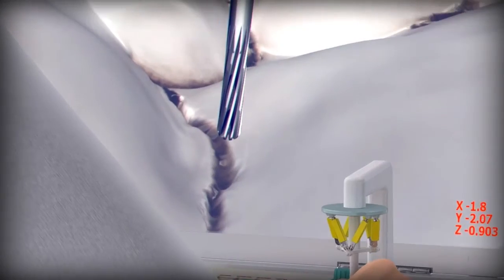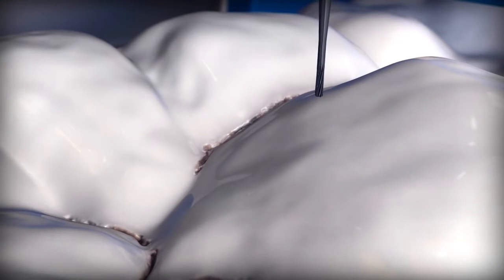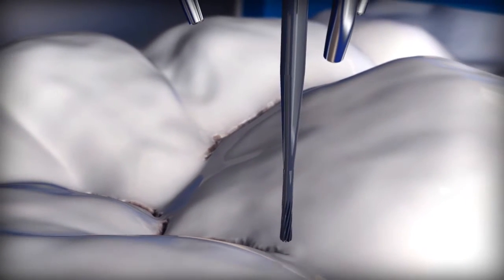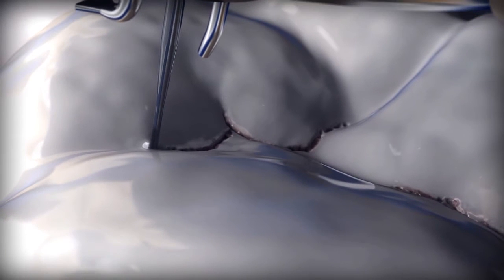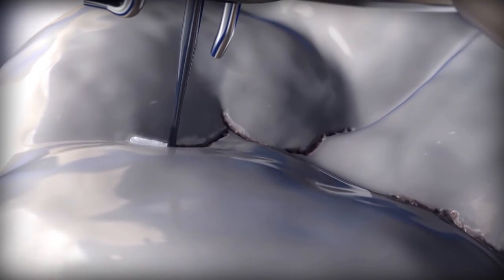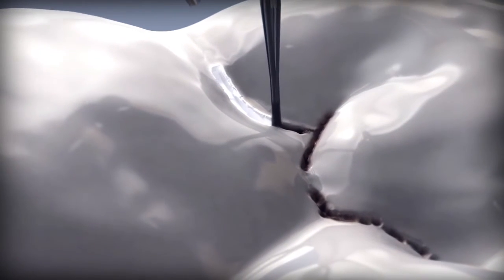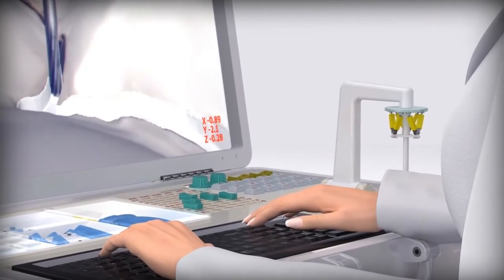The technician monitors the position of the device in space with a precision of up to a few dozen microns. Once the route has been set, the technician runs the program. The drill begins to rotate, descending into the tissue of the tooth at a pre-set depth and moving along a pre-determined pathway. The technician observes the device as it executes the program and makes sure everything goes according to plan.